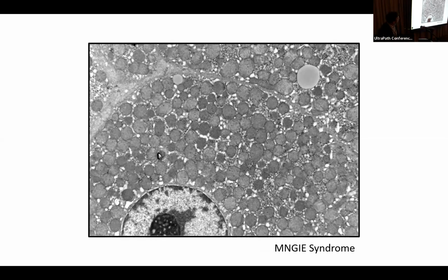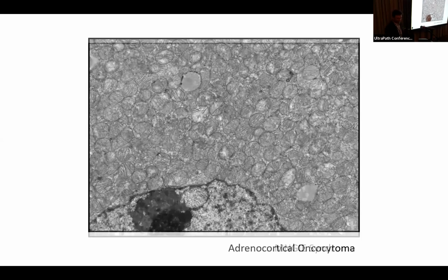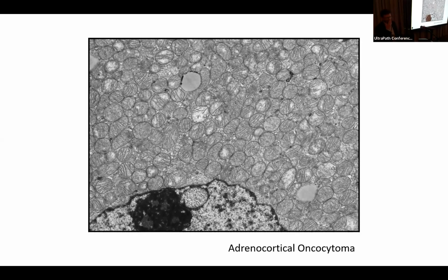And when you see this many mitochondria, this is what we call oncocytic change. Basically, they're trying to compensate in number for what they lack in functionality. This process can get really out of hand in tumor cells, resulting in the mitochondria-packed cytoplasm characteristic of oncocytomas.